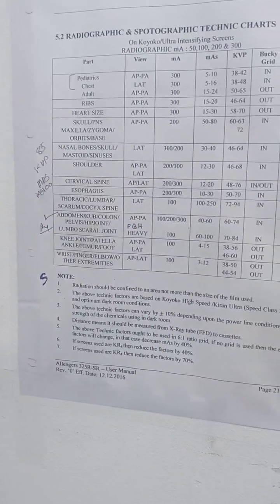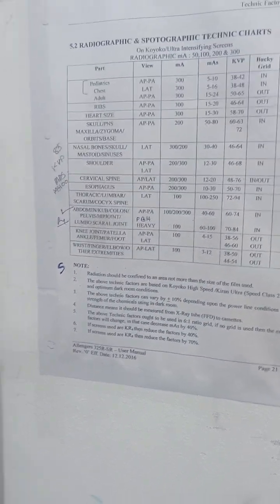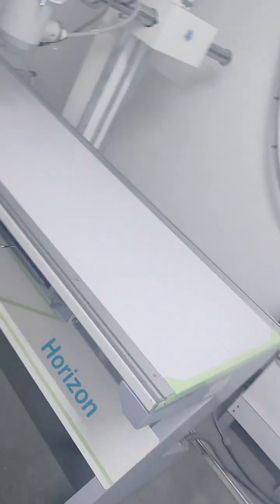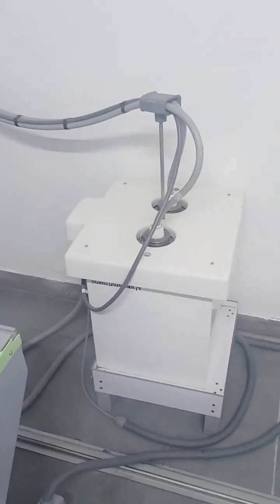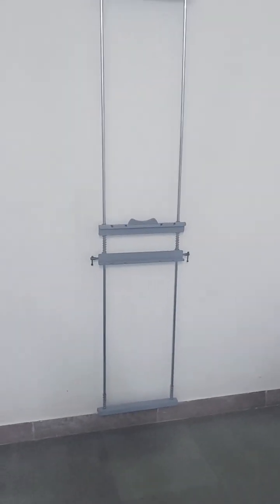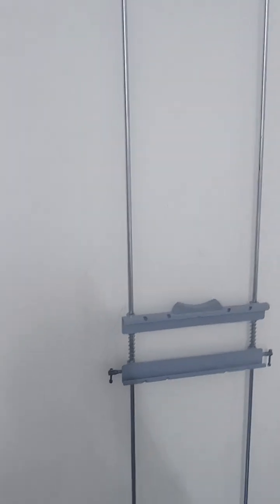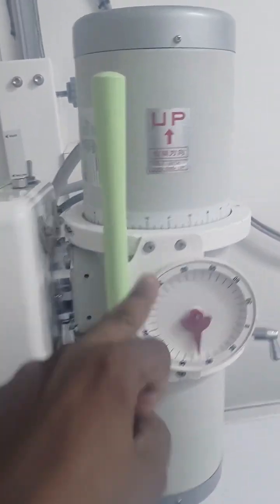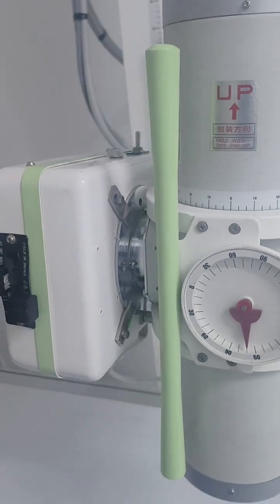These are the couch CR system and the three-phase generator. Here is the tray for taking the cassette. This is a standing x-ray unit, and these are the 350 mA rotating anode tube.